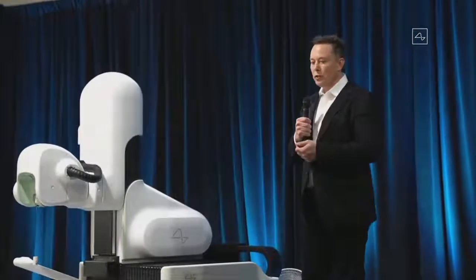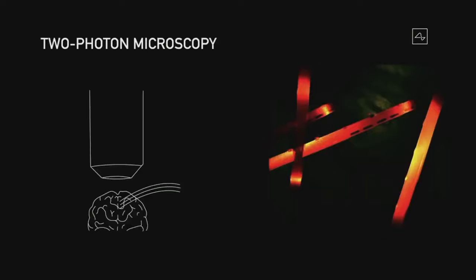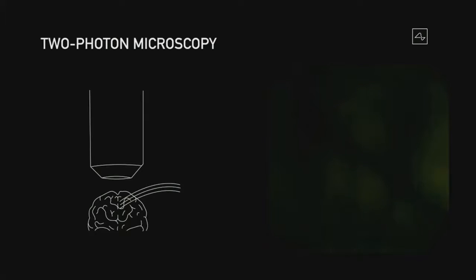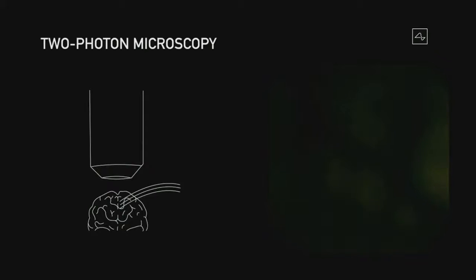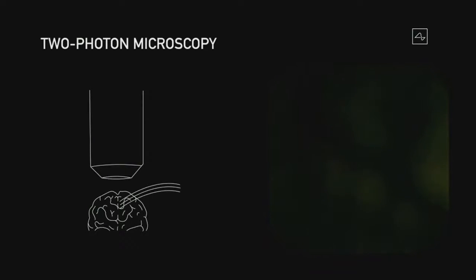Now, in terms of writing to the brain or stimulating neurons, we also need precise control of the electric field in space and time. We need a wide range of current for different brain regions. Some regions require delicate stimulation, some require a lot of current, and you want, obviously, no harm to the brain over time. And part of the way we analyze the stimulating neurons is with 2-photon microscopy. I always have trouble pronouncing that, microscopy.